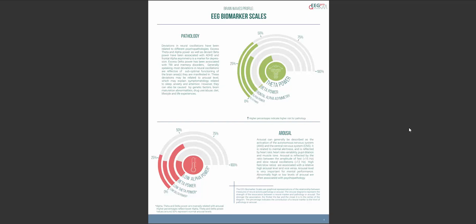First, the thicker the bar, the more scientific support. And second, the closer the bar to the center of the graph, the more scientific support. So the closer to the center and the thicker the bar, the more scientific support for the relationship between deviations in that measure and pathology in general. This means that deviations in theta power are most relevant for pathology, while deviations in delta power have the least scientific support regarding its relation with pathology.